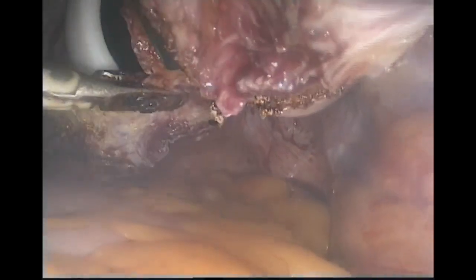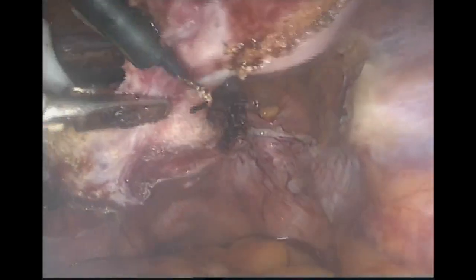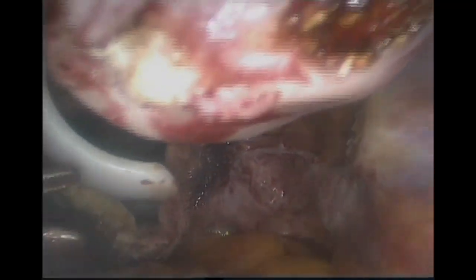division. Go hemostatic. Do not let anything bleed. Do not let anything be injured. Don't let anything be damaged, such as the small intestine, the bowel, the large bowel, or the bladder. Go circumferentially, incise onto the tip of the cup. The cup maintains the pneumoperitoneum.